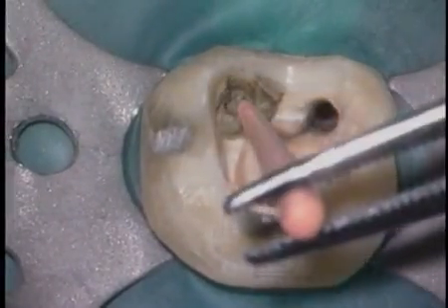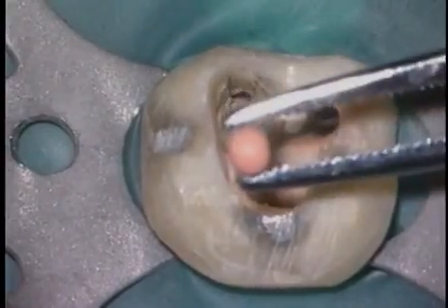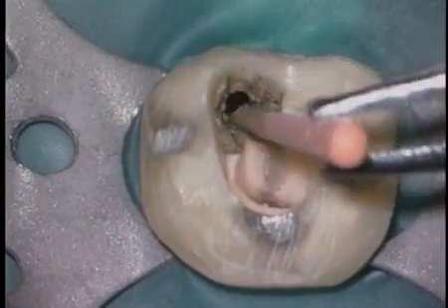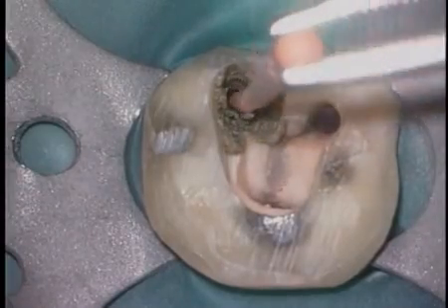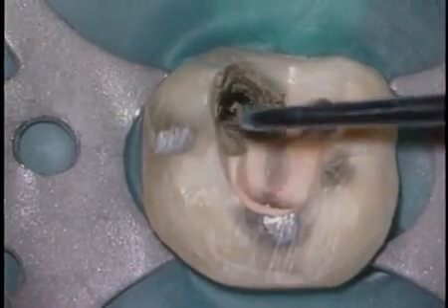MTA is placed into the orifice. A flexible gutta-percha point can gently shepherd the material in an apical vector. Swirling the cone in an arc adapts the MTA to the walls nicely. More MTA is progressively added, and again, the gutta-percha point moves it down through the canal so that it can be passed out through the perf defect and establish the repair.